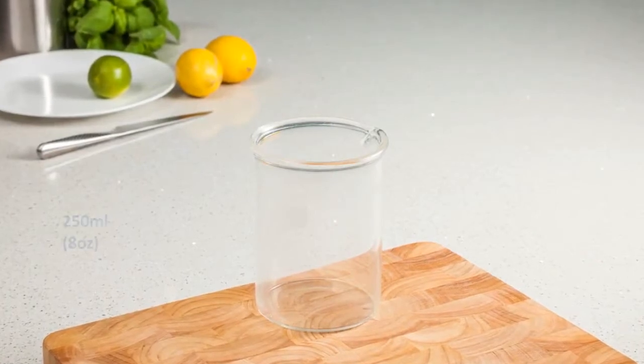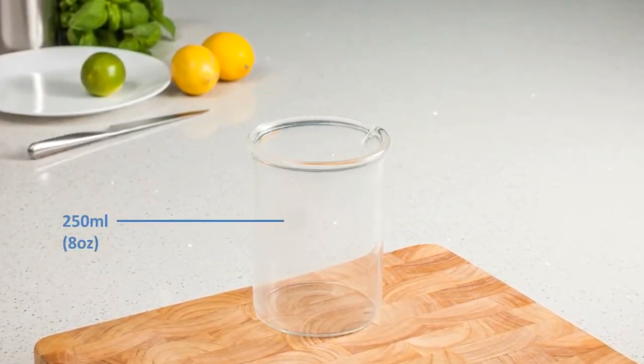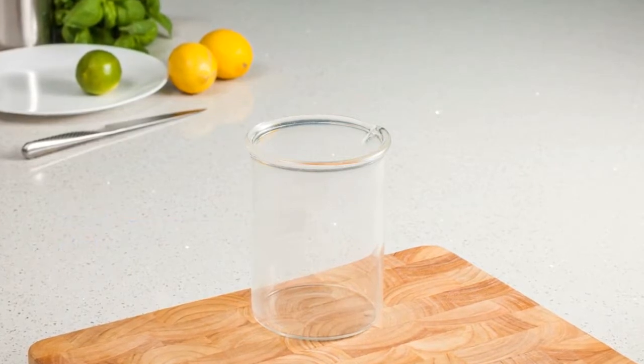First, you'll need a suitable container. A 250ml or 8oz container like this one would be ideal.